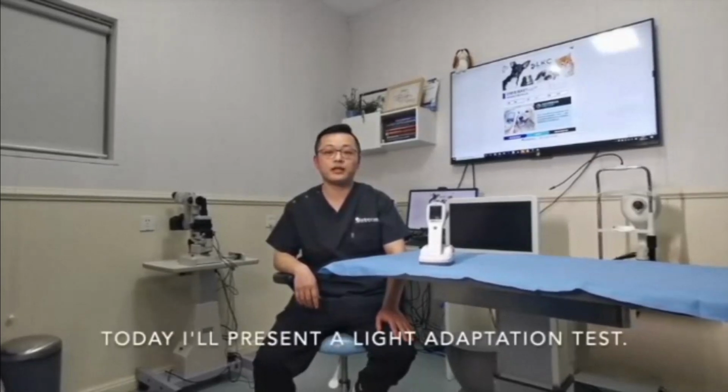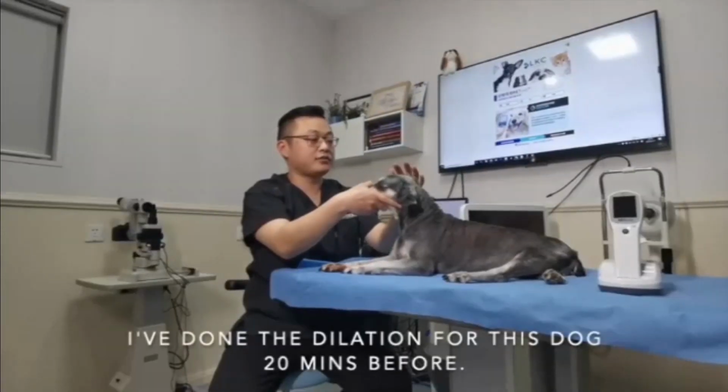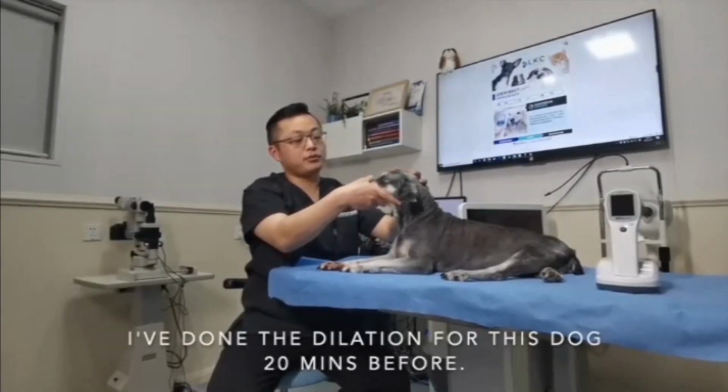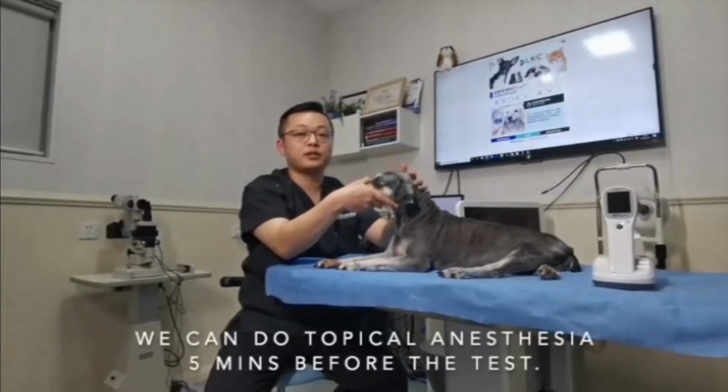I'm Hui from Shanghai Phyllis Pet Ophthalmology Clinic. Today, I will present a light adaptation test. I have done the dilation for this dog 20 minutes before. We can do the topical anesthesia 5 minutes before the test.